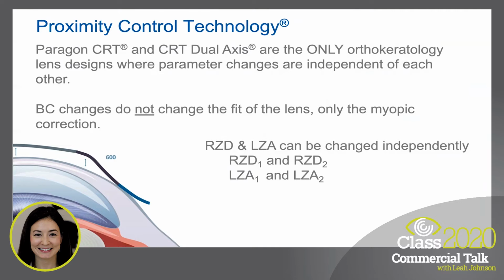Our RZD is a sigmoid curve and can be changed independently from the base curve or other curves of the lens. Lastly, we have a landing zone angle, and this also can be changed independently. In addition, you can have two parameters customized at 90-degree meridians, so you can have an RZD1 and an RZD2, or an LZA1 and an LZA2.